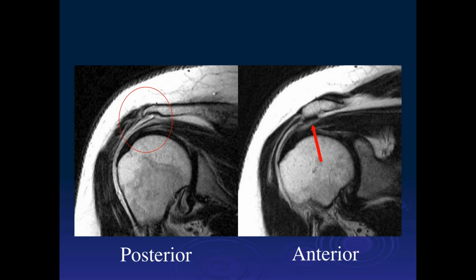Oh, I'm sorry, I did this wrong. The acromioplasty. I'm sorry, I'm interrupting him.